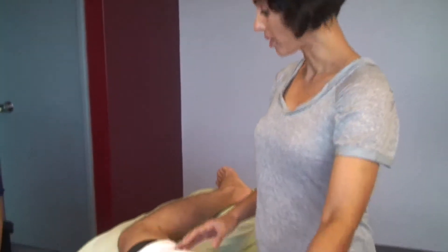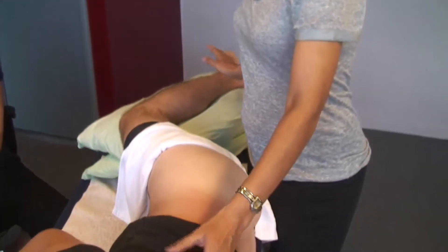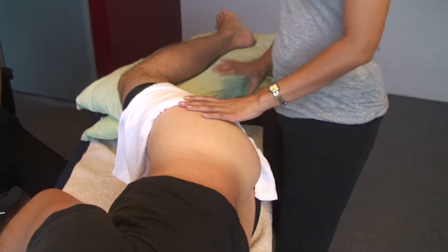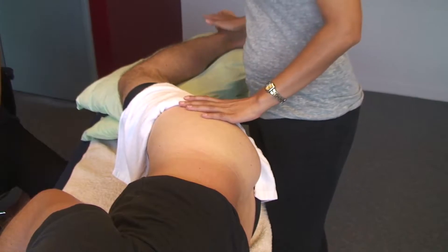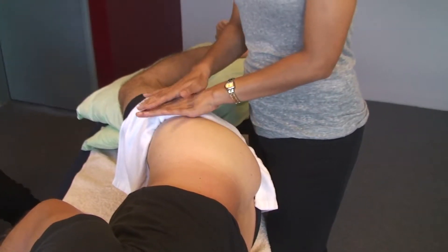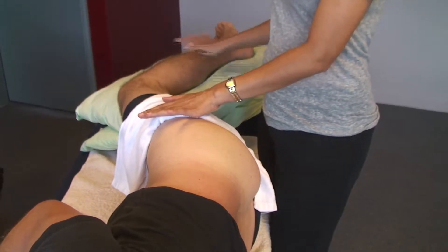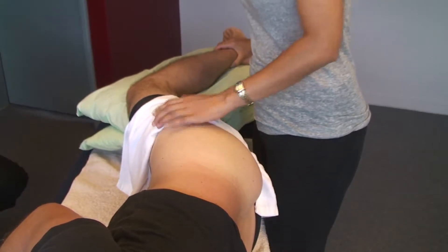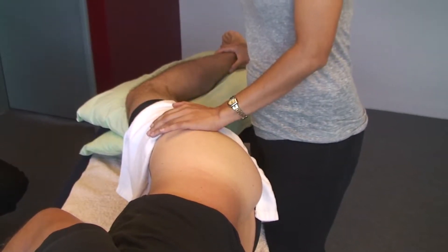We're going to look at how to assess gluteus minimus using real-time ultrasound. The first thing we want to set up is your patient position. They need to be lying on their side, and it's useful to have a couple of pillows between their knees. Try to set up so that the hip, the greater trochanter, the knee and the ankle are almost parallel, with hips flexed about 60 degrees.